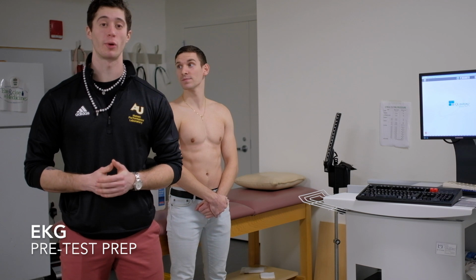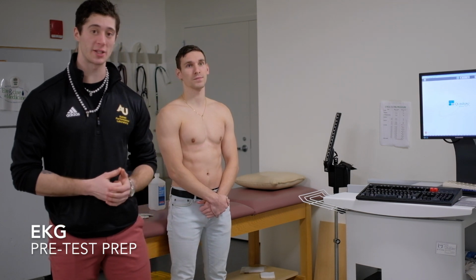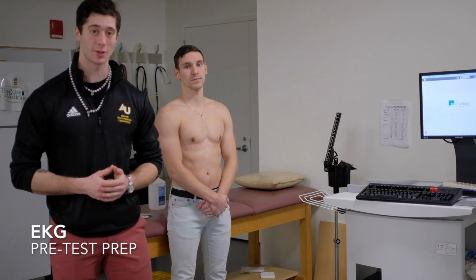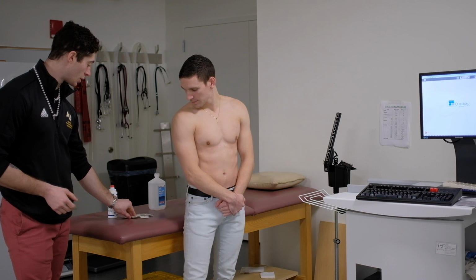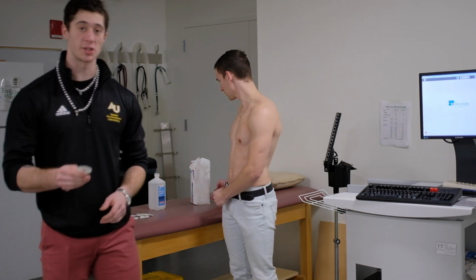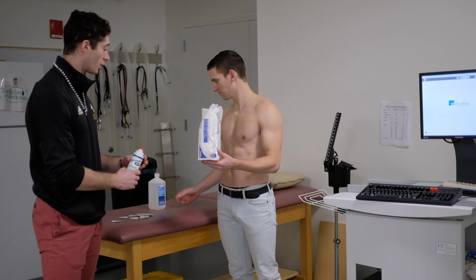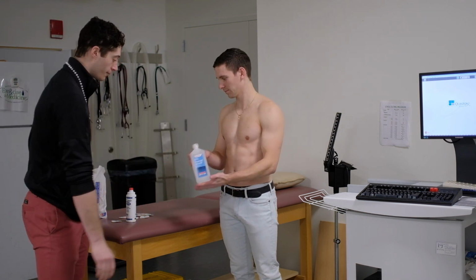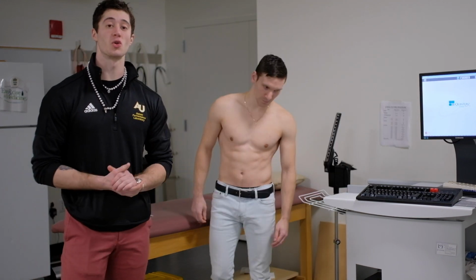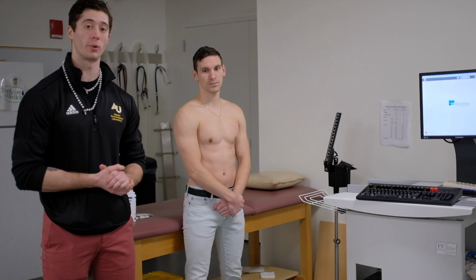Today we're going to be going through a stress test, EKG setup, lead placement, and how to start the test. First, what we have to do is ensure that we have all the proper materials. So, for our EKG system, we need 10 of these electrodes, we need gauze, ultrasound gel, and alcohol. It's also important to note that you should know and have your defibrillator handy.